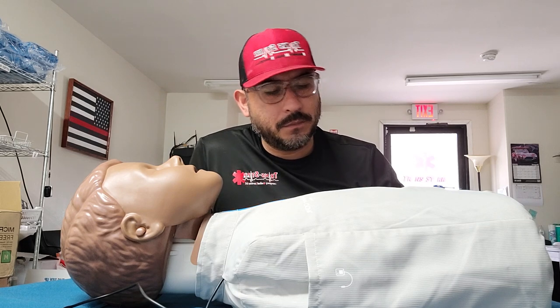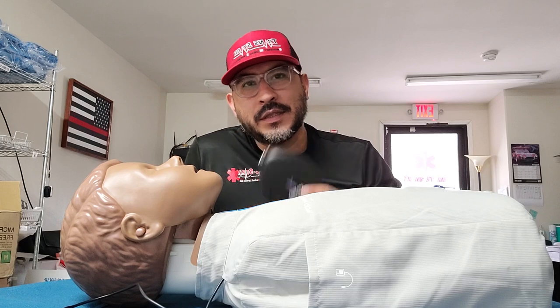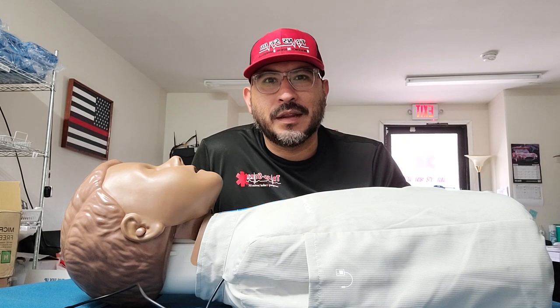Today we're going to talk about this pocket mask that I bought at Amazon, and we're also going to talk about these — they're called practice shields. These are for CPR whenever you're going to give a breath to the person that you're rescuing, the victim, the patient. You might want to use one of these so there's an actual barrier between you and the patient, so they're not going to be passing any virus, respiratory infection, or anything like that.